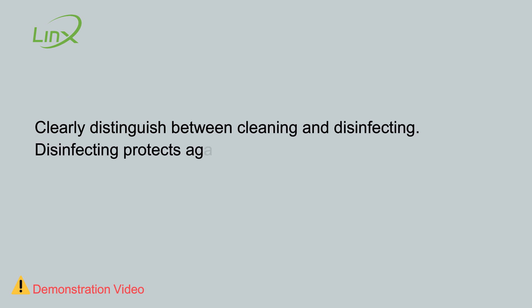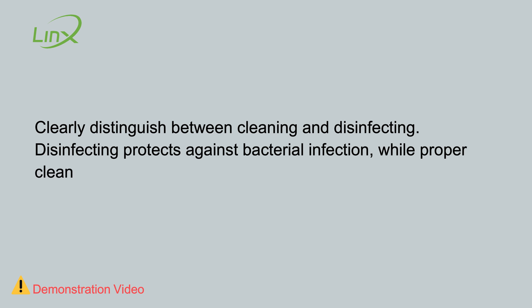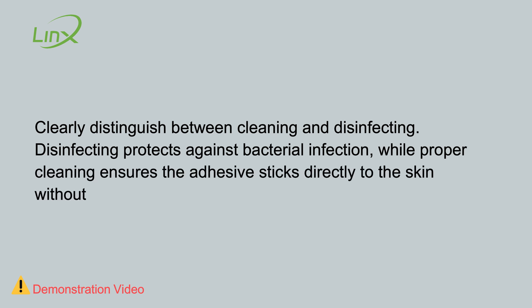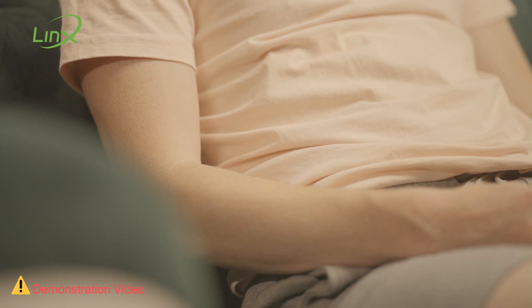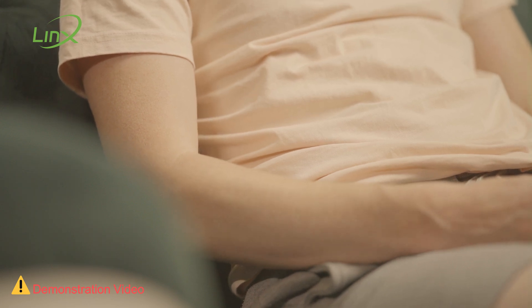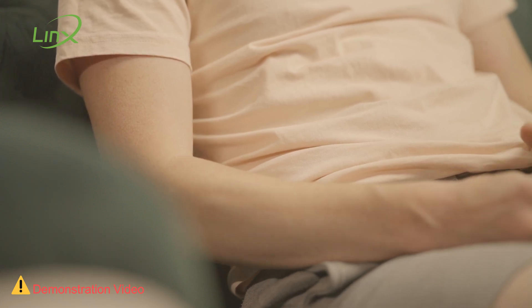Note: clearly distinguish between cleaning and disinfecting. Disinfecting protects against bacterial infection, while proper cleaning ensures the adhesive sticks directly to the skin without barriers, helping maintain the sensor's stability throughout its use. After disinfecting the skin with alcohol, let it air dry without using a towel or tissue.